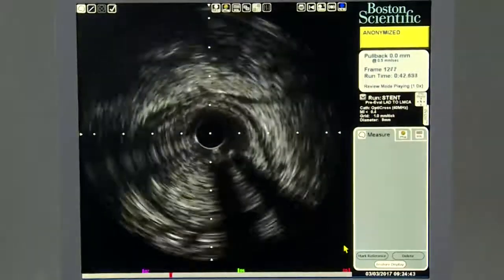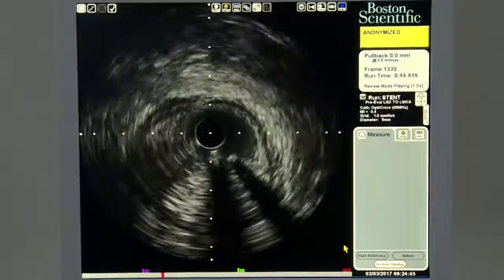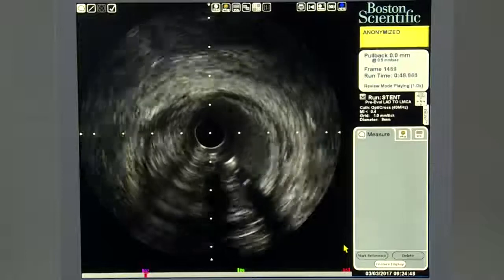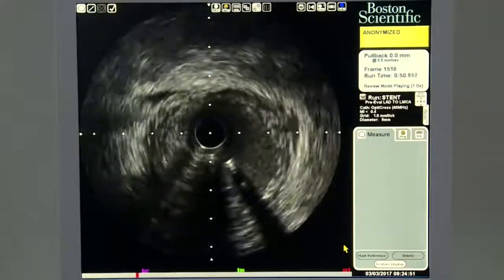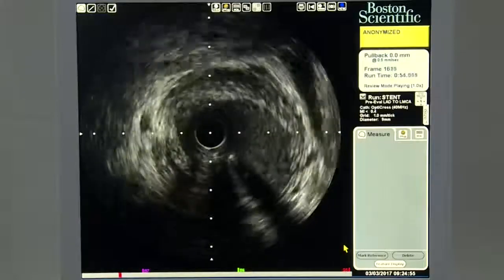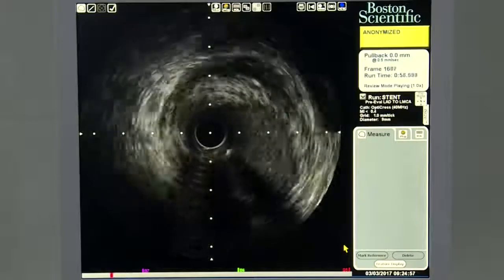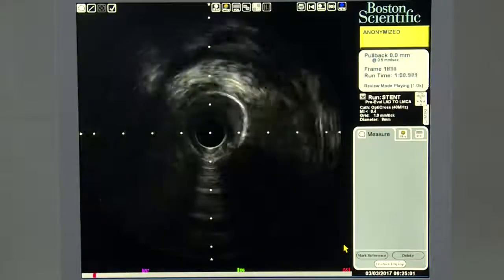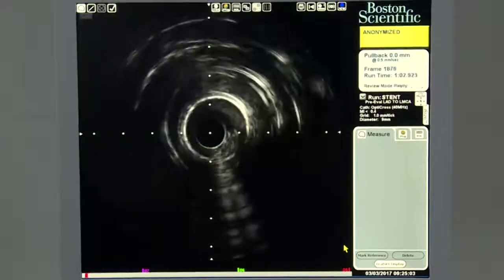And as we pull it further, left main looks about 4 plus, 4.5. And as we go towards the ostium, the atheroma burden decreases. And right near the aorto-ostium, it looks reasonably okay, but still there is atheroma, so we'll have to cover it from the ostium itself. Sir, and we are there in the aorta. Next.